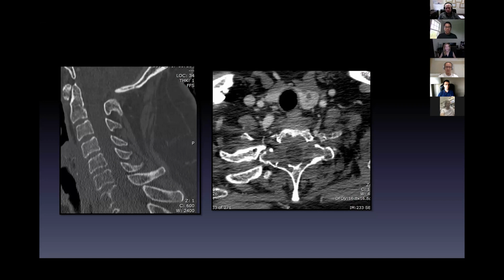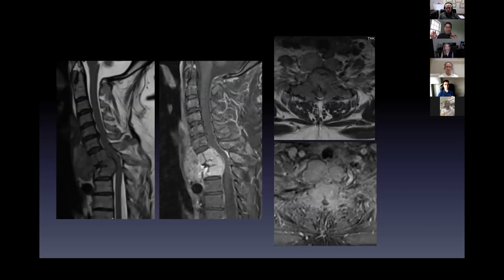Because I think for most neurosurgeons and orthopedic surgeons, we're not really looking for the trachea or the esophagus or where the carotid is, or lymph nodes or things like that. And when you look at a radiology textbook, they've got nice color captions for where everything is. It may be helpful to shed some light on how you approach it. We can see what's obviously there, but do you have a kind of workflow?